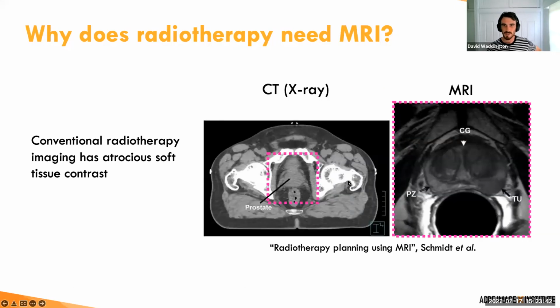To give you a comparison, we have someone with prostate cancer. On the left, you see that the prostate, this region here, has a really even grey tone across the whole thing. On the right-hand side, we have an MRI zoomed in of the same prostate, and you can see we get all this amazing structure that also shows the tumour at this location. That's because T1 and T2 are different between the tumour and the healthy prostate, and we can turn that into an image.